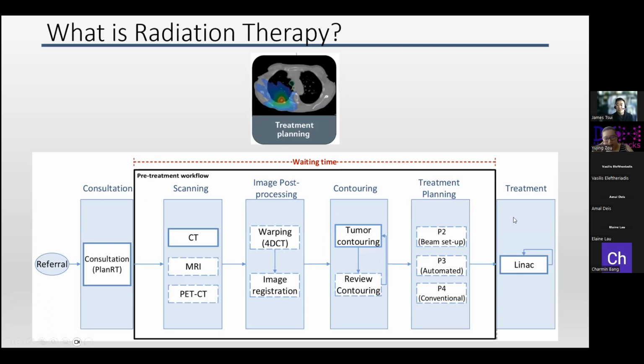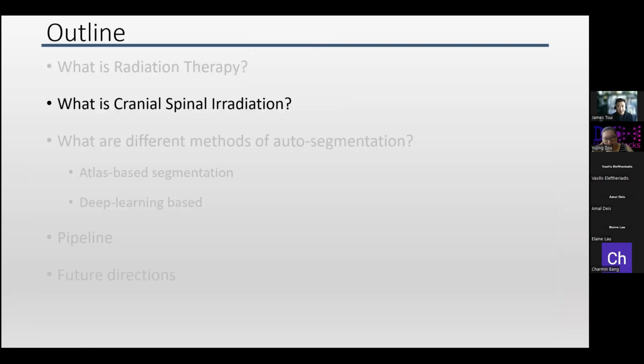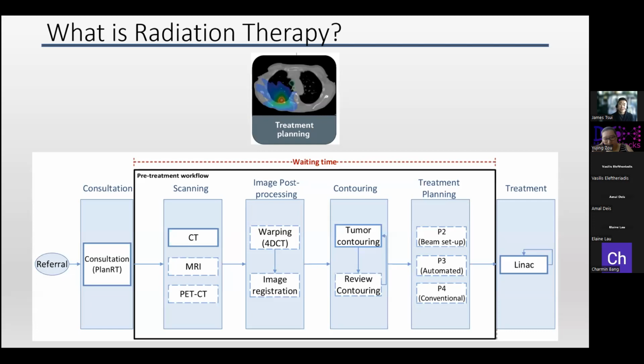During the time between consultation and treatment time, the patient is just at home waiting. So in addition to the quality assurance process with auto segmentation, we could actually help with the contouring part and minimize, at least shorten, the waiting time.